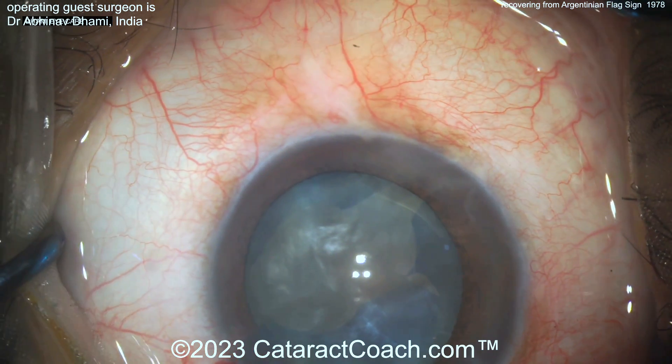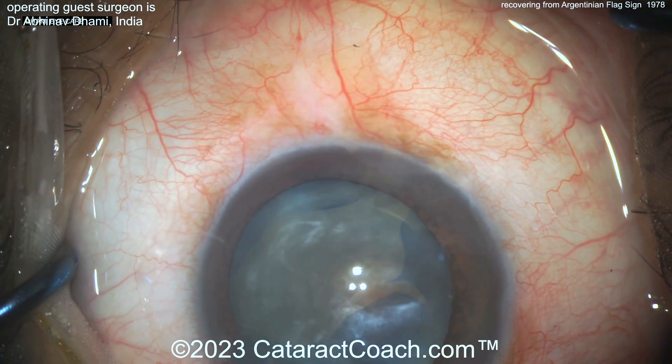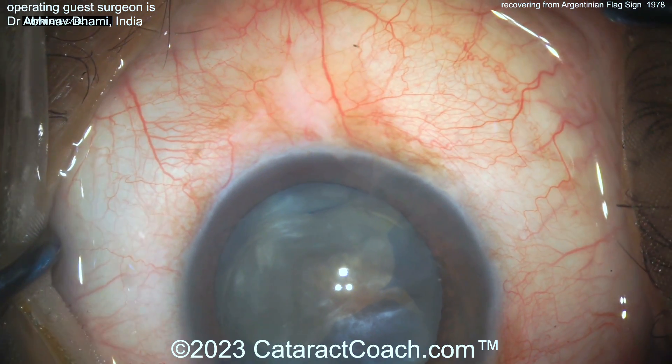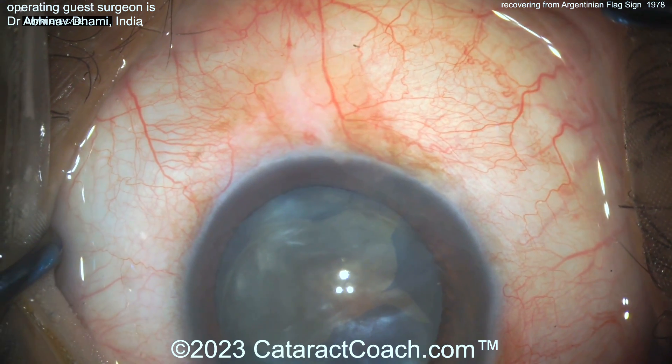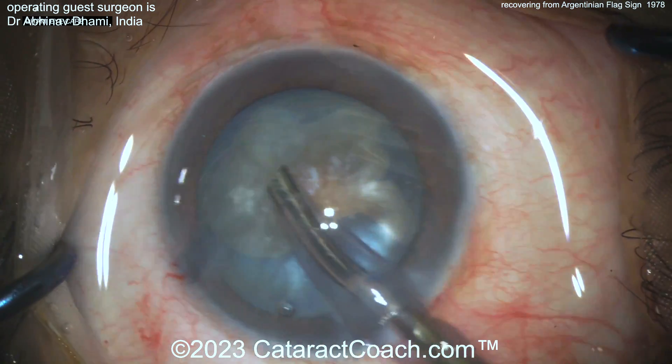That's tough. In a case like this, I really like needle decompression or FACO probe decompression. We've talked about many other devices: precision pulse capsulotomy, femtosecond laser — if you want to do a femto, do that. You can also buzz in with the FACO probe, needle aspirate, or do a double-rhexis technique. We've shown all of this on Cataract Coach.